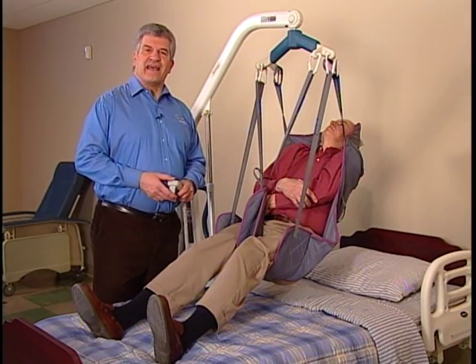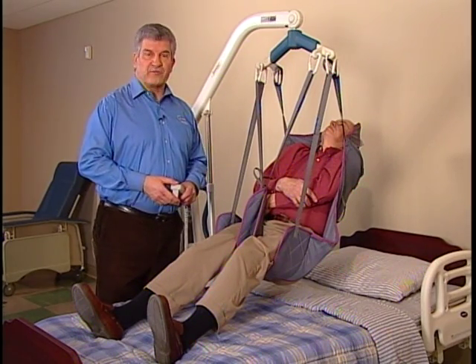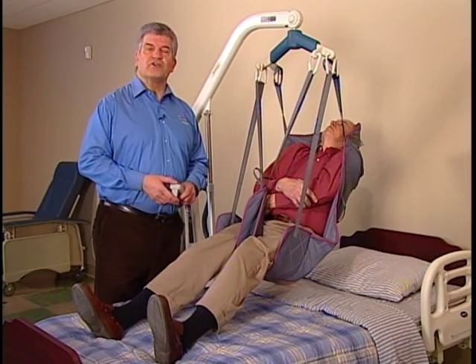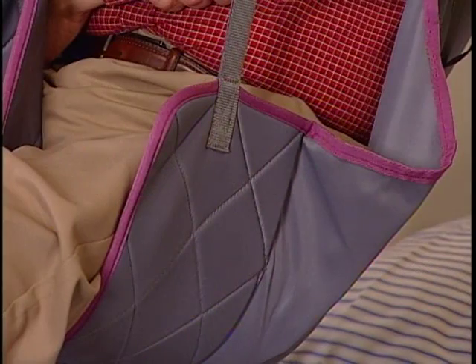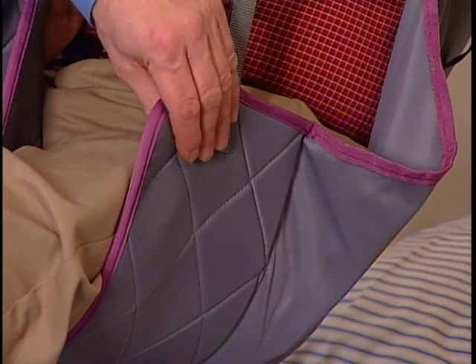Invacare Divided Leg, Universal, and Easy Fit slings are constructed of durable materials that resist deterioration from moisture and laundering. They're constructed of a unique fully padded fabric that forms a soft yet supportive surface.